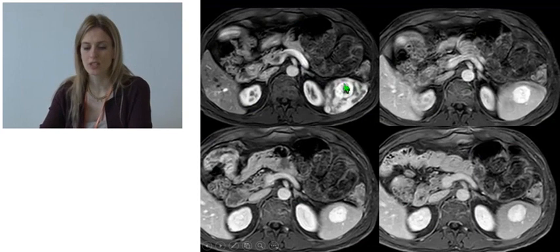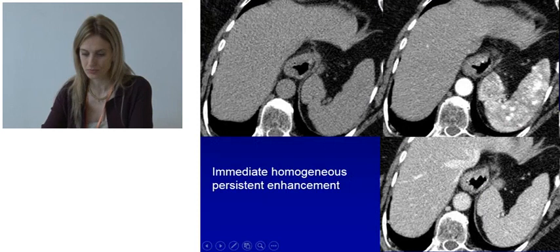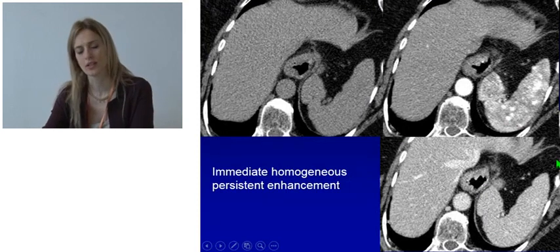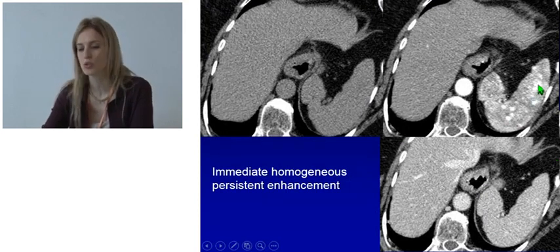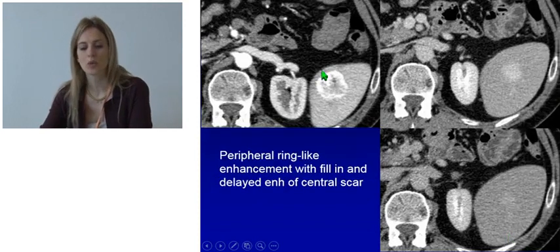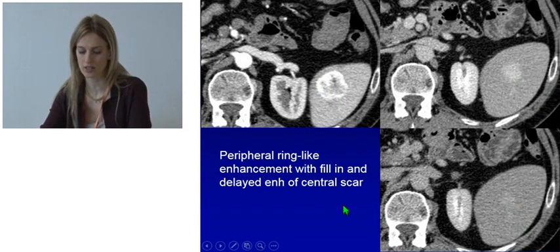Here we can see one example of a peripheral ring enhancement followed by fill-in of the lesion. These same patterns of enhancement can also be seen on CT. For example, here we can see immediate homogeneous enhancement which is then persistent, and in this other case we can see peripheral ring enhancement followed by fill-in and a delayed enhancement of the central scar.